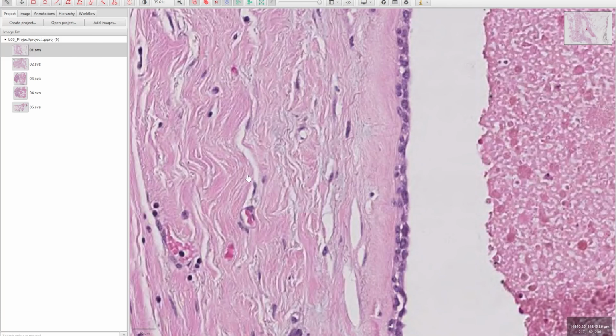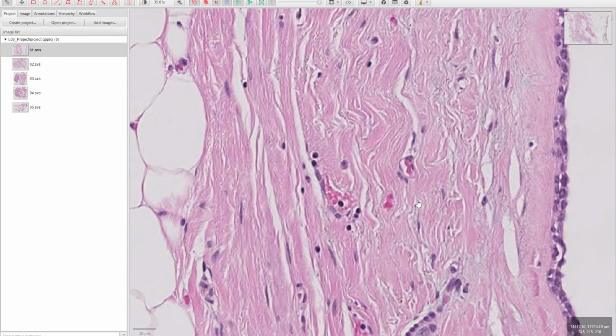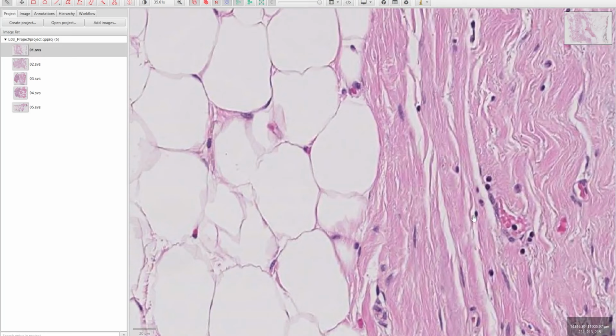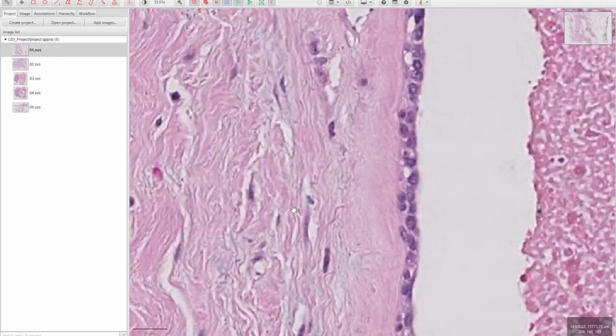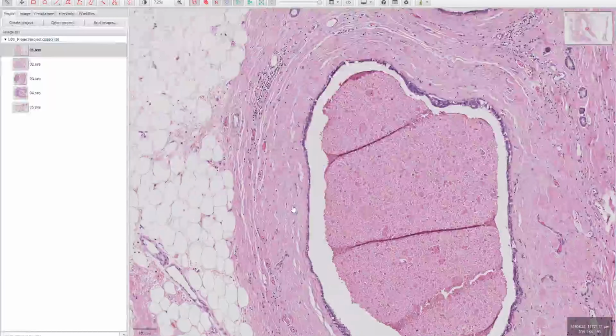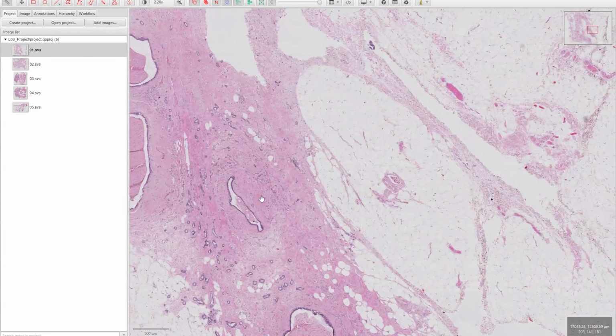As you see here, we are zooming out right now until we reach a reasonable zoom, which is here 20 micrometer. And as you see here, you are seeing different nuclei, cytoplasm, boundaries, and fats. So to work on the specific details, you are targeting the highest zoom or the highest magnification level. And if you need an abstract view or a global view, you can zoom out and get insights on a specific region from an abstract view.